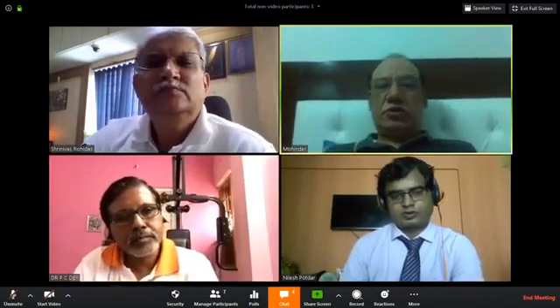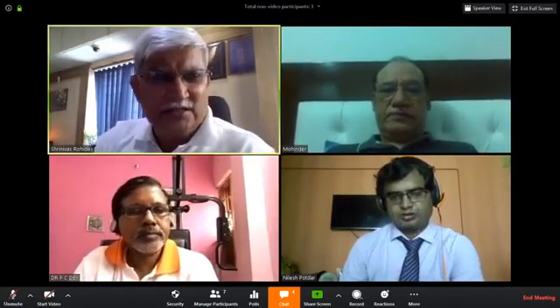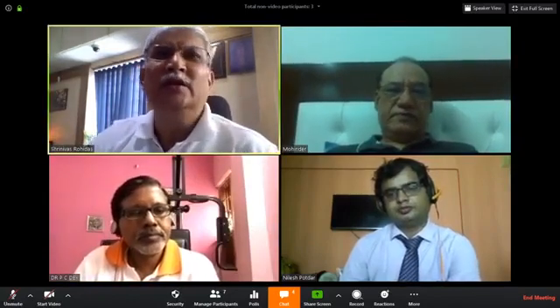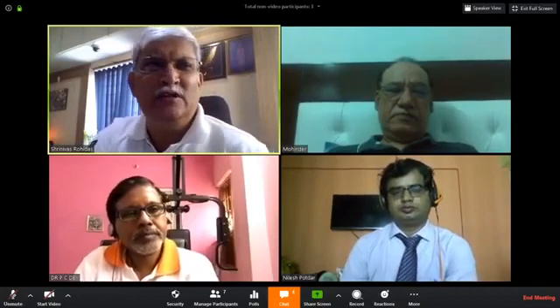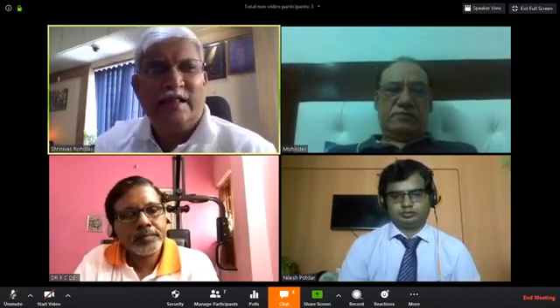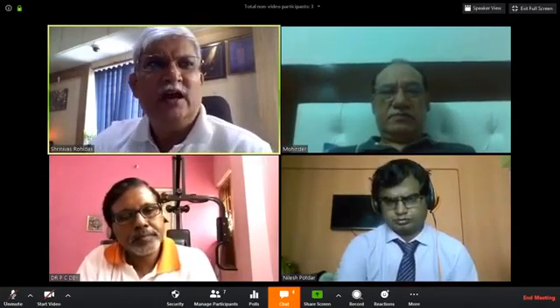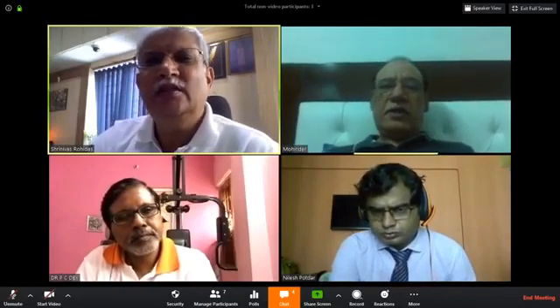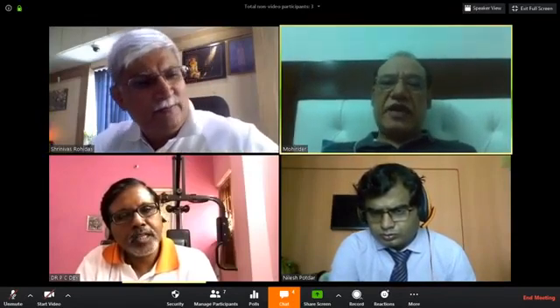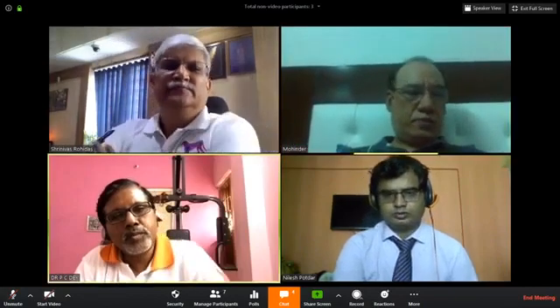Dr. Rohidas, your take. In a hard disc, suppose it's a fixed disc, there is no movement, just decompress posteriorly. But sometimes we find that the annulus is hardened, somewhat calcified, then we open it with the drill, go inside the disc space and decompress it. Here, the surgeon has to decide on the table what kind of situation there is. Sometimes in stenosis cases.